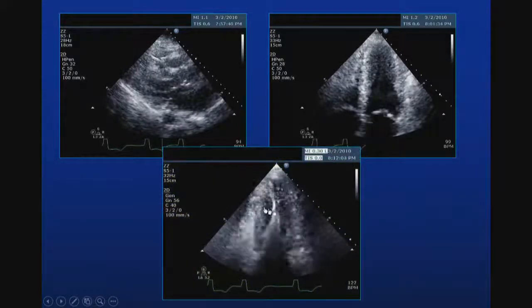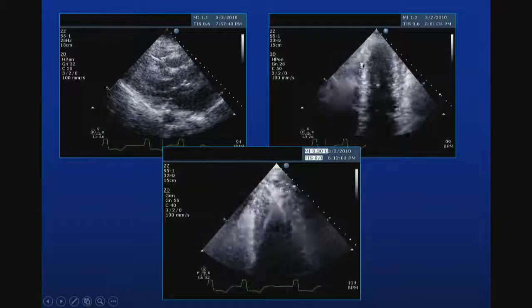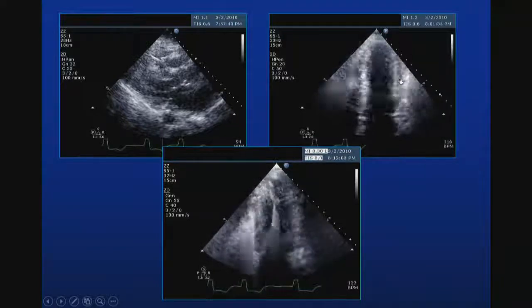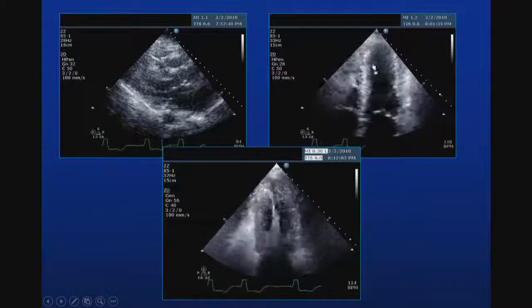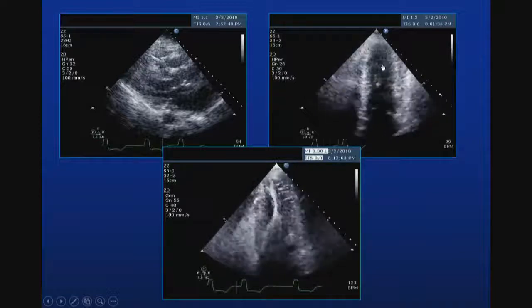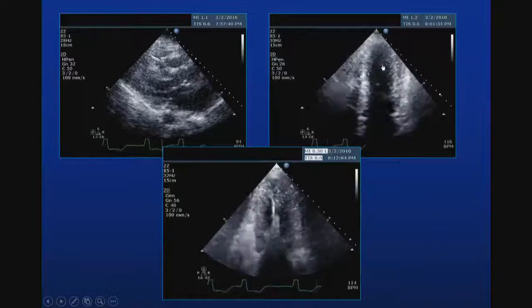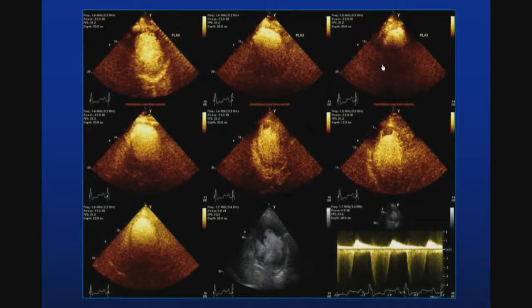And what it is, is a very extensive apical hypertrophic cardiomyopathy. You could see the intramural arterioles that are coming in because they're large and have a lot of flow. The clue from here, if you go back, is if you have no epicardial motion, either there is a wall motion abnormality inside here, right? Or you have a lot of hypertrophy and there isn't much room for the endocardium to move further inward. So please, if you see something like this, you have to use contrast to enhance what you did.